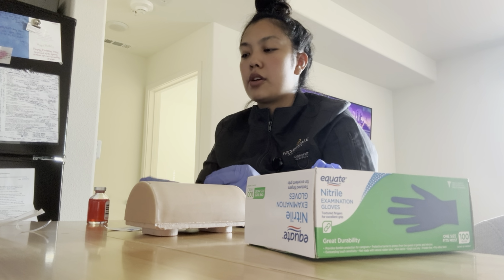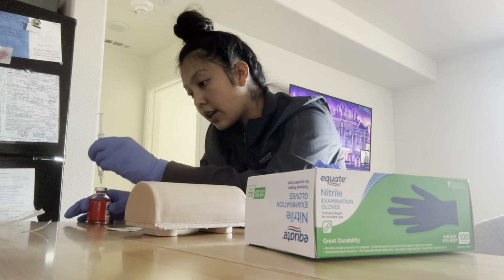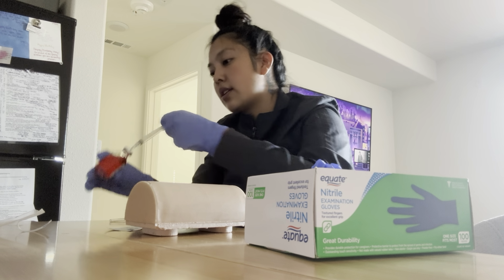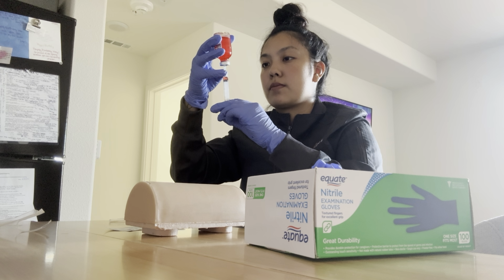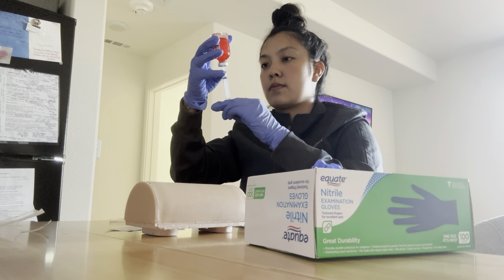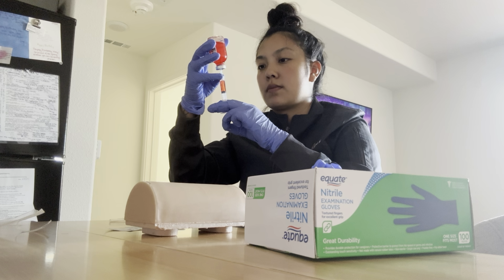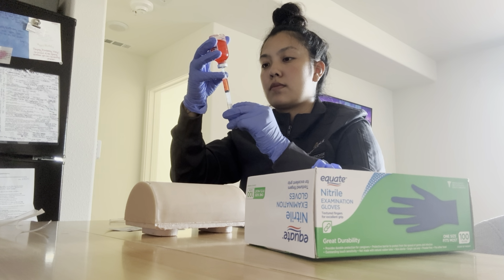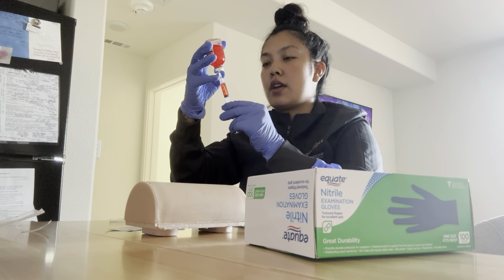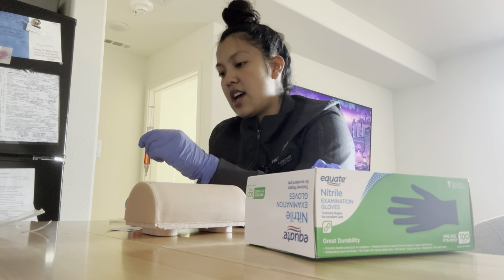Perfect. So now I'm going to uncap this. Inject the air into the medication. Going to invert. Okay, I'm going to take this out.